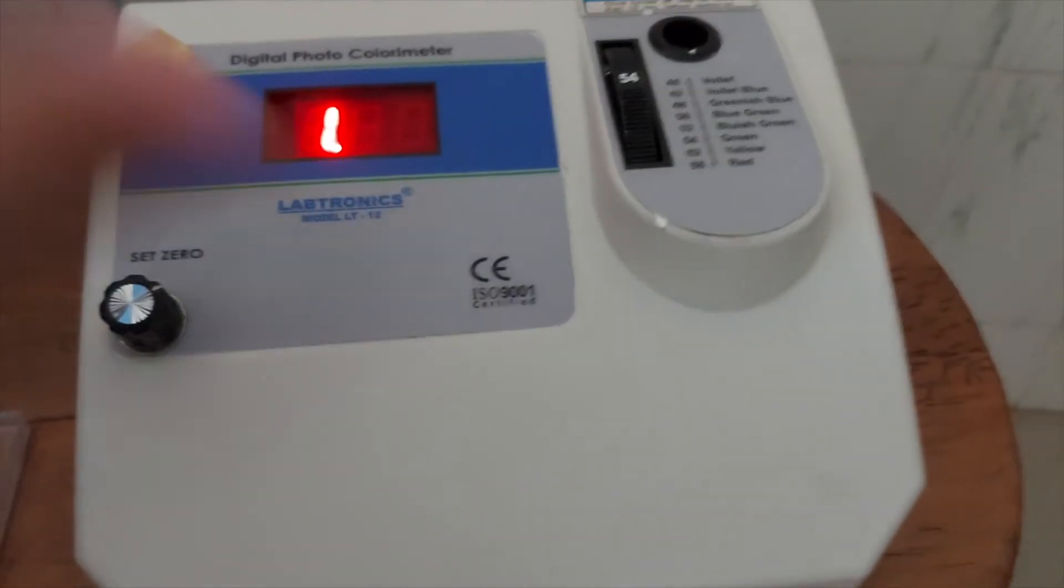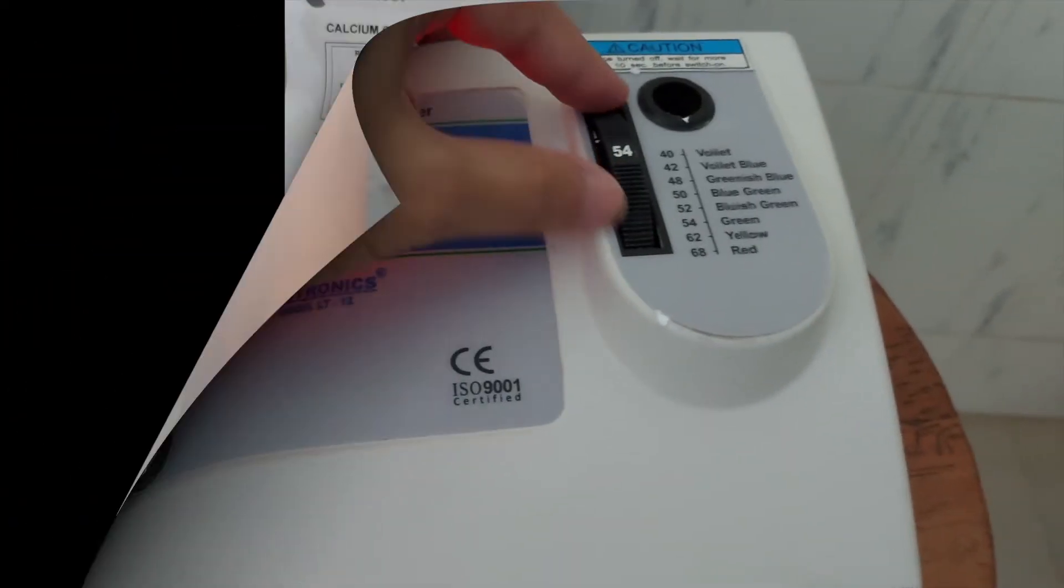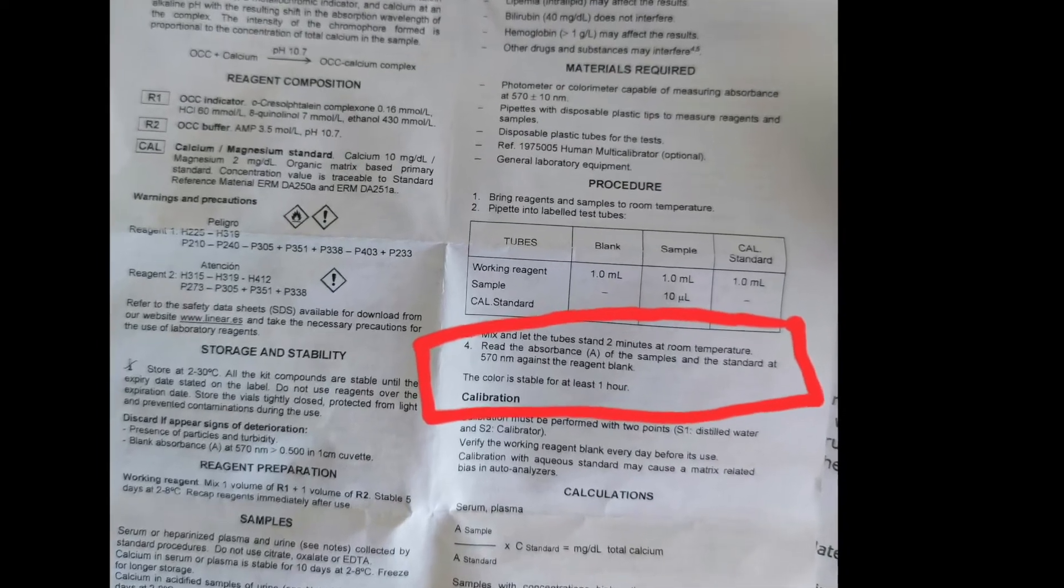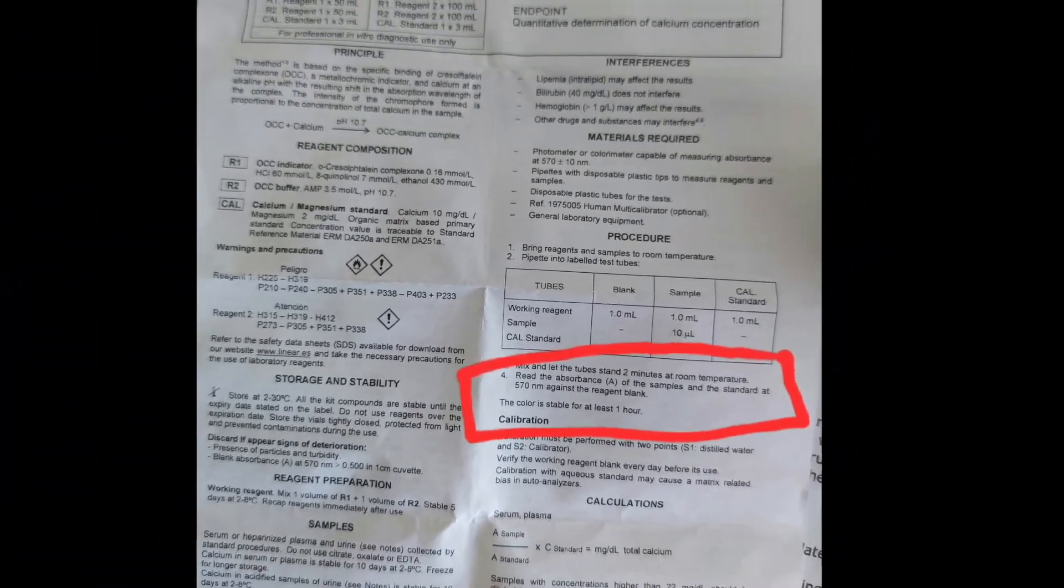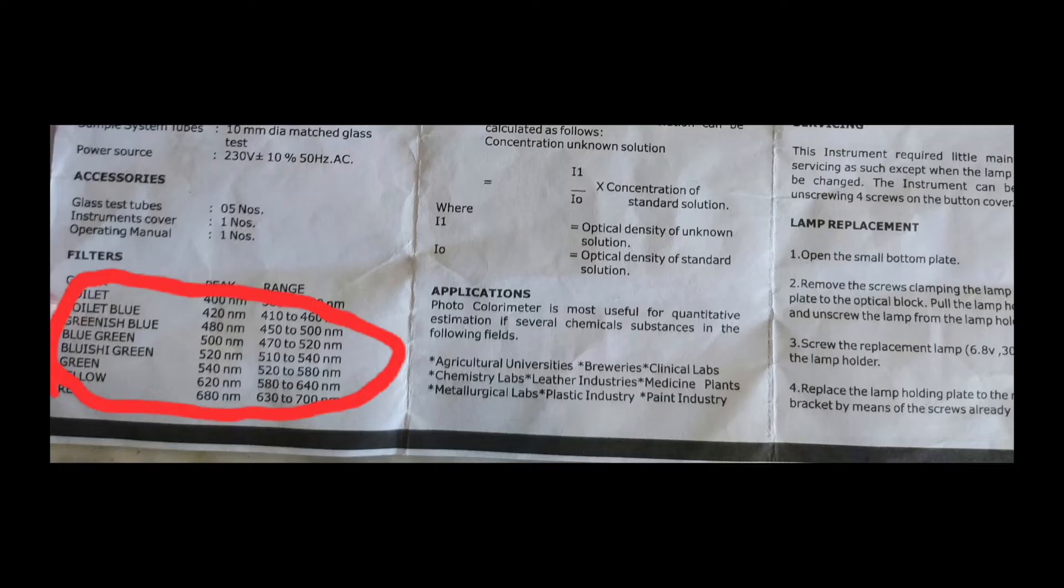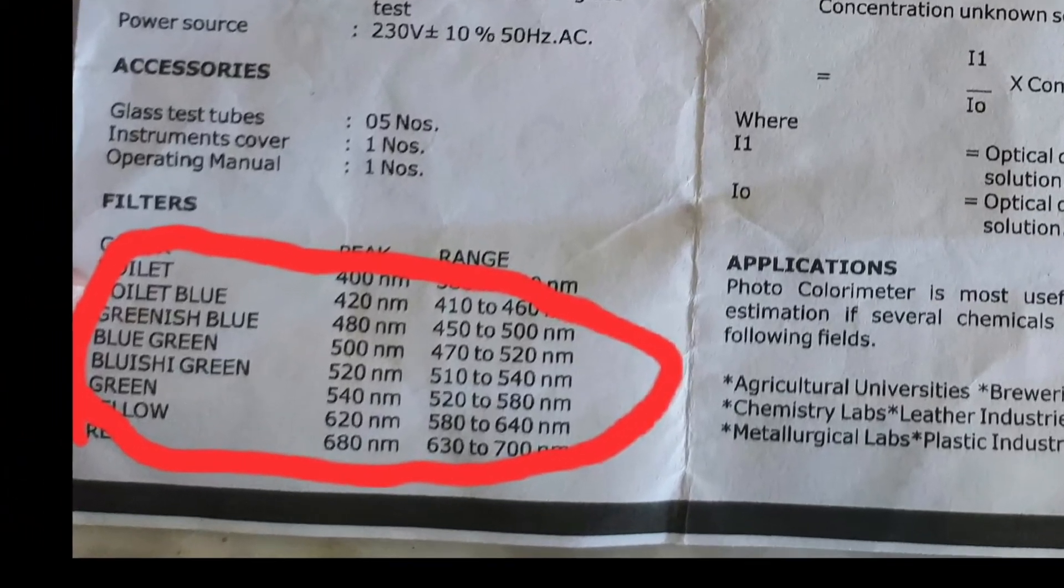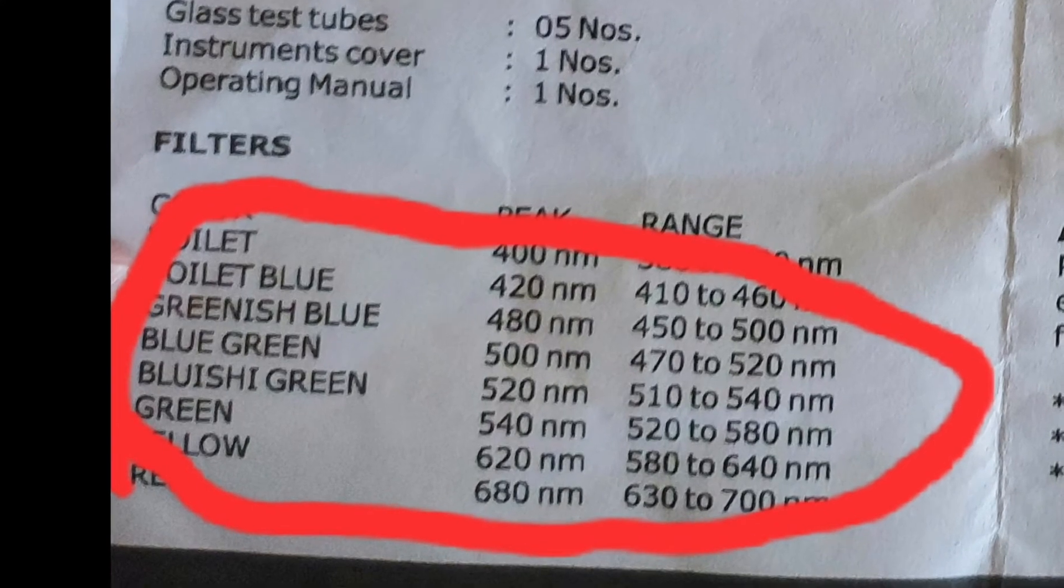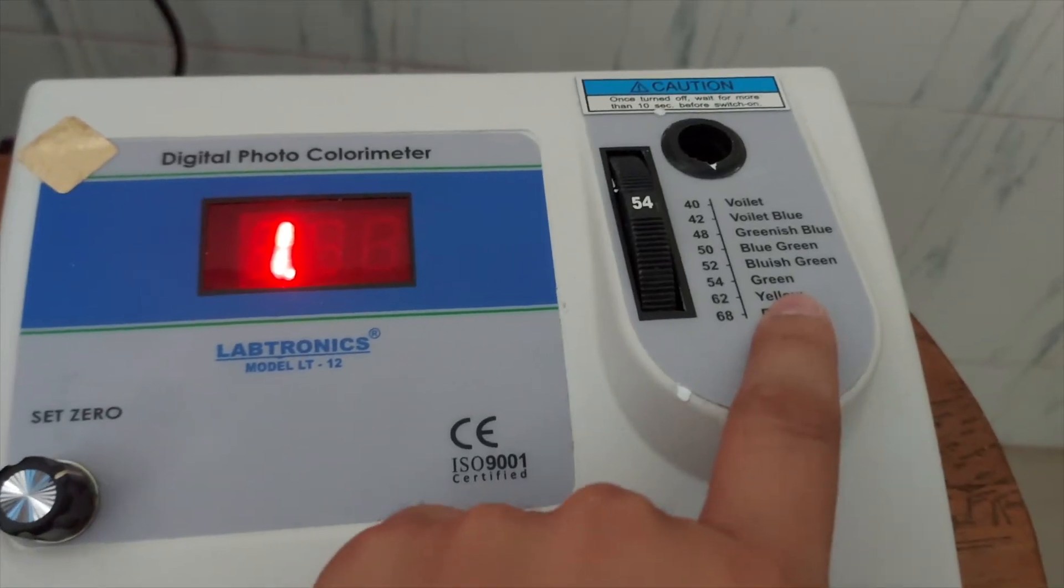At this point, we have to adjust the disk. As per the instruction, we have to take the reading at 570 nanometers, and the manual says it falls within the green range, so we have to set the disk to green, which is 54.